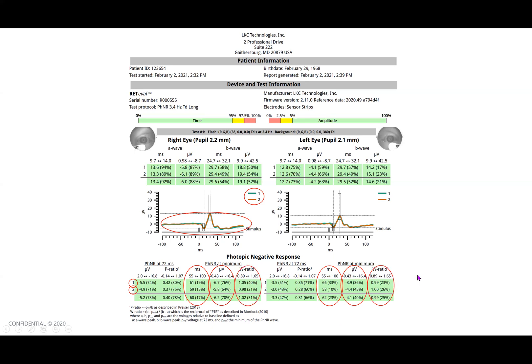And then the last thing I'll look at is this W ratio. W ratio is a measure of how the electrical current is traveling through the different layers of the retina, from the photoreceptors to the retinal ganglion cells. And you want to preserve as much of that signal as possible. And so for this particular W ratio, I want to look at is the number as close to one as possible or above one. That indicates good signal preservation. That means there's no damage that's somehow impeding the electrical signal from traveling from one layer of the retina to the other. This is a good snapshot measurement, but it's also another measure that you can look at over time. So look at it now, six months from now, a year from now, are things getting worse? Yes, this patient could be getting worse from a glaucoma standpoint.